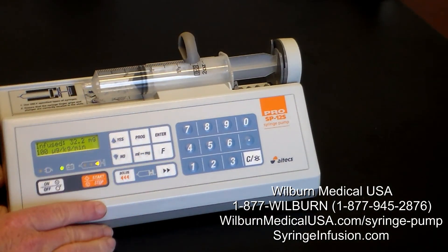It's very simple, it's very cost-effective. I'm confident you'll be happy for many years with your decision to use the Aitecs SP-12S for anesthesia applications. Thank you so much.